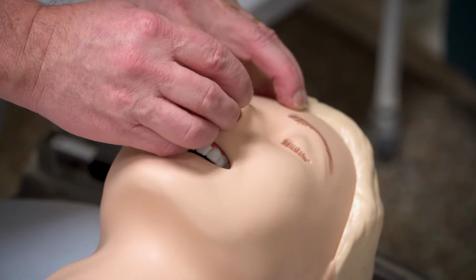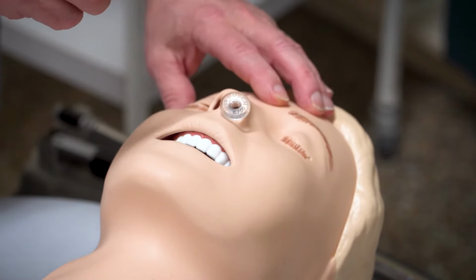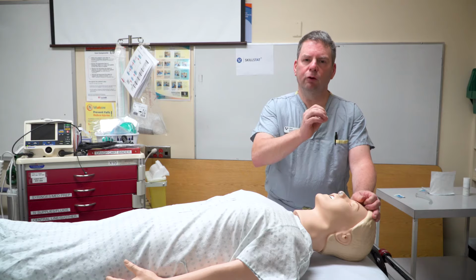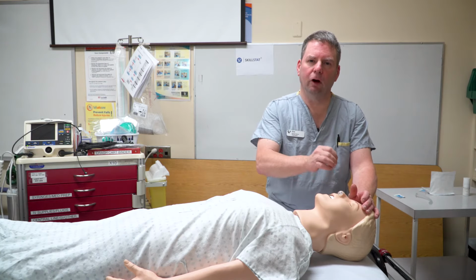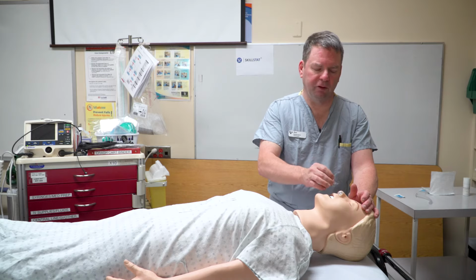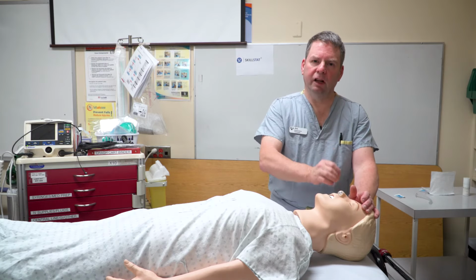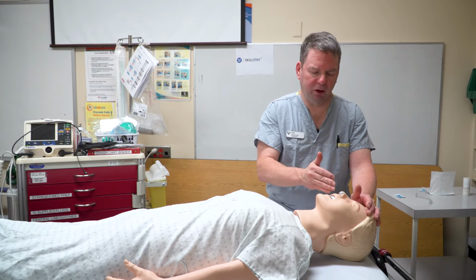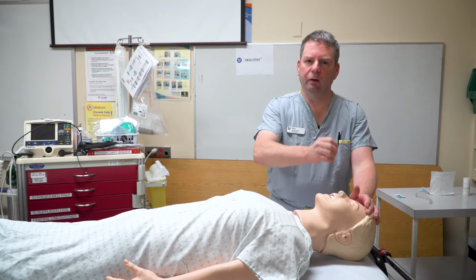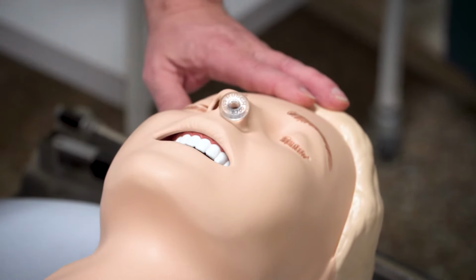When it's going in, you want to ensure that you're not going against any pressure. You don't want to force it in. If you come against resistance and you push it past the resistance, you'll often cause a nosebleed, which will make things more difficult. So if you find that on one side it's tight, just take it out, put it in the other side. A lot of people have a septum that's deviated in one way. You can't really tell by looking from the outside, but on the inside, one side should be loose and the other side should be tight. Put it in the side that it fits in best.